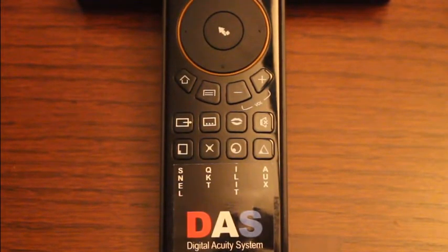Welcome to the DAS Digital Acuity demonstration video. I will start by explaining how simple our remote control is to use.